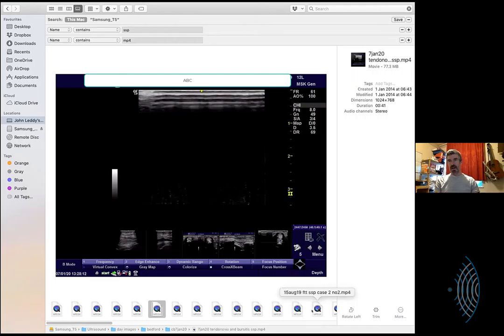Why is the echo texture seemingly darker? Because the cells that make up an epithelial layer are more like columns. Fibrous tissue like this is bright. Fibrous tissue and epithelial tissue like this is dark. And when it's irritated, it's dark and full of water, so it's extra dark.